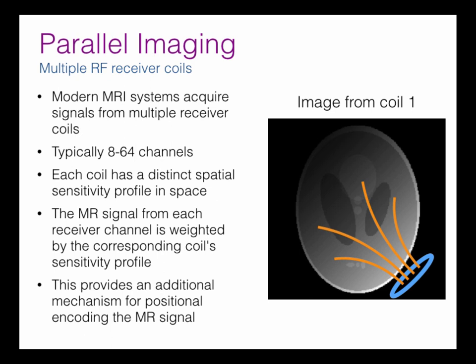And this is basically the B1 field lines that would be induced if you put a current around this coil, because it's reciprocal. I know we're detecting the magnetic field rather than creating it, but it works in reverse too. So you can think of it as just having this kind of pattern, and because the field lines are stronger close to the surface, which incidentally is where we're mostly interested in looking, you get a much stronger signal there. Potentially it's kind of like a gradient. It gives us an additional degree of freedom to do our spatial encoding.